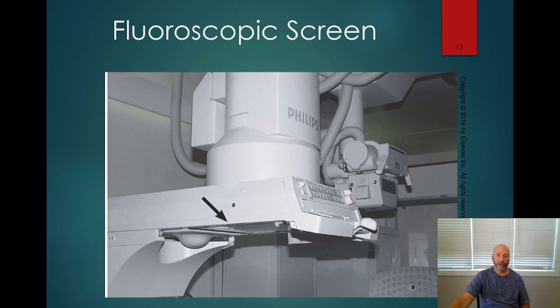So your fluoroscope, traditional fluoroscopy, this big apparatus here is actually the image receptor. So this entire thing is an image receptor. The X-ray tube is inside of the table. So this is an RF room because we've also got a X-ray tube here. So we can do both. We can do fluoroscopy and also radiography as well.